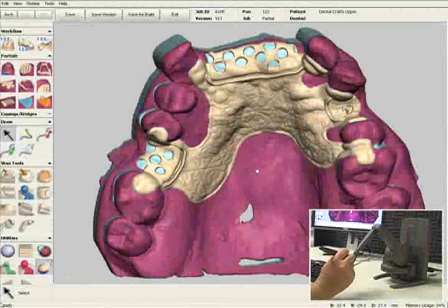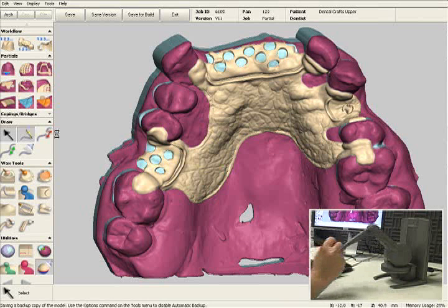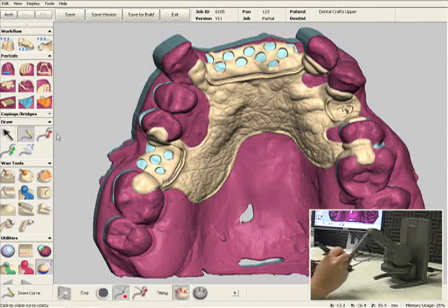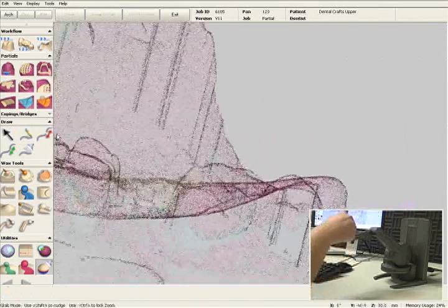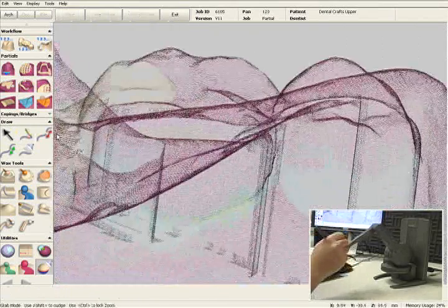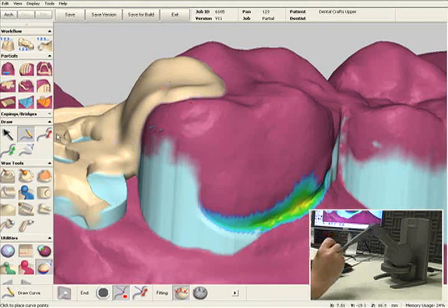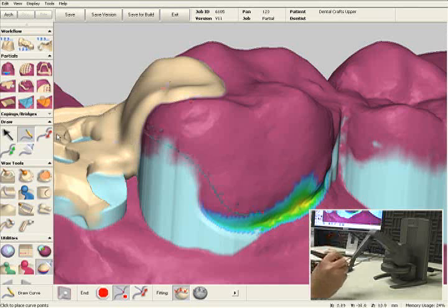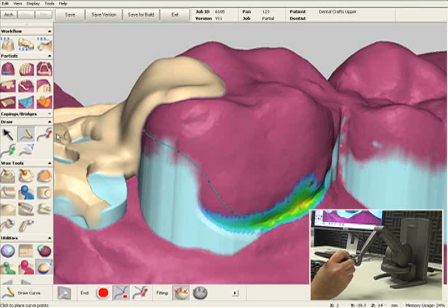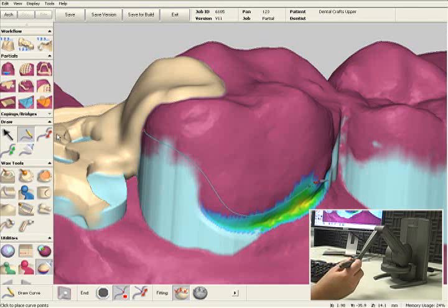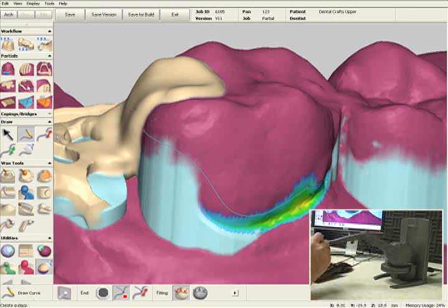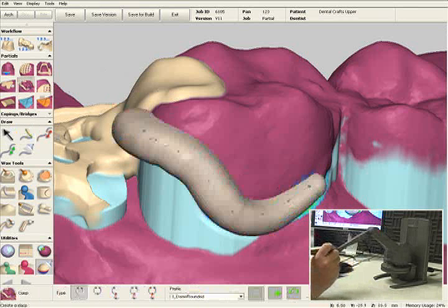Now we'll design the clasps. I'm going to select the pencil tool and design an Akers clasp on the molar. I'm going to rotate the model so the buckle is facing me, and I'm going to draw a line which will represent the center line of the clasp. I'll end it in the undercut — that's where the tip of the clasp is going to be — and I'll select the clasp tool and click on the line.